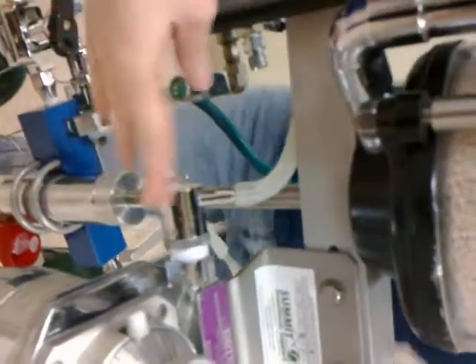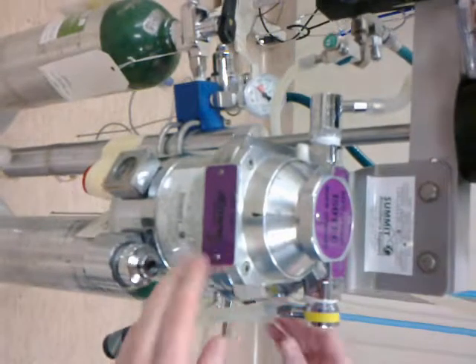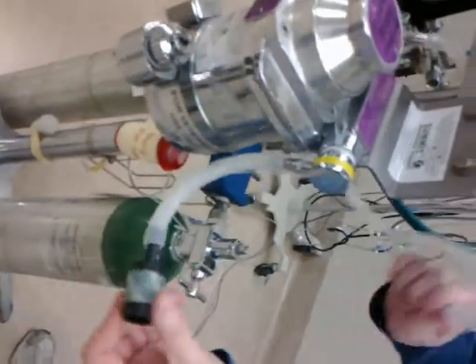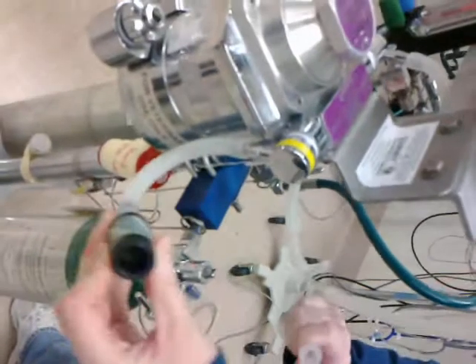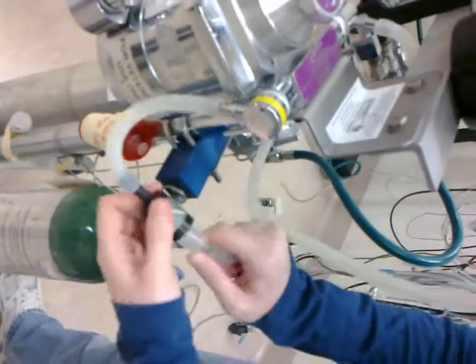The tube goes all the way to the vaporizer inlet here. Gas goes into the vaporizer, comes out the vaporizer outlet here, which will be attached either to a rebreathing or non-rebreathing system. For our purposes, we're doing a rebreathing system, so we attach it here.